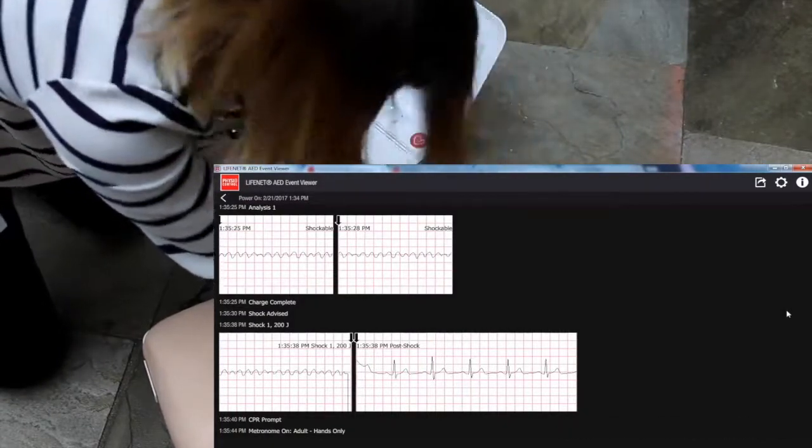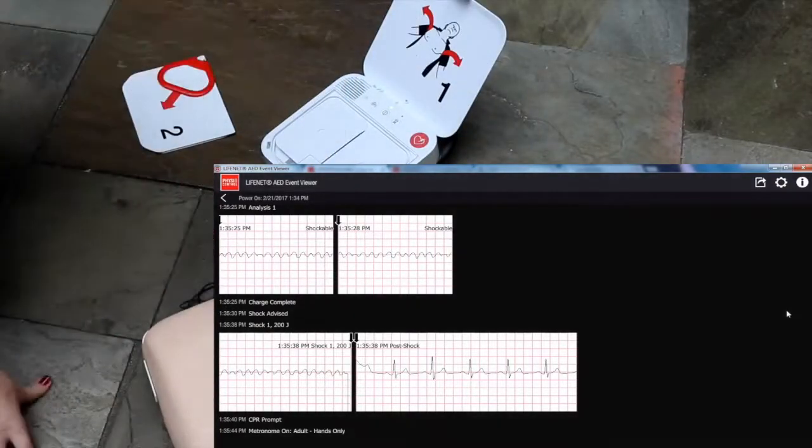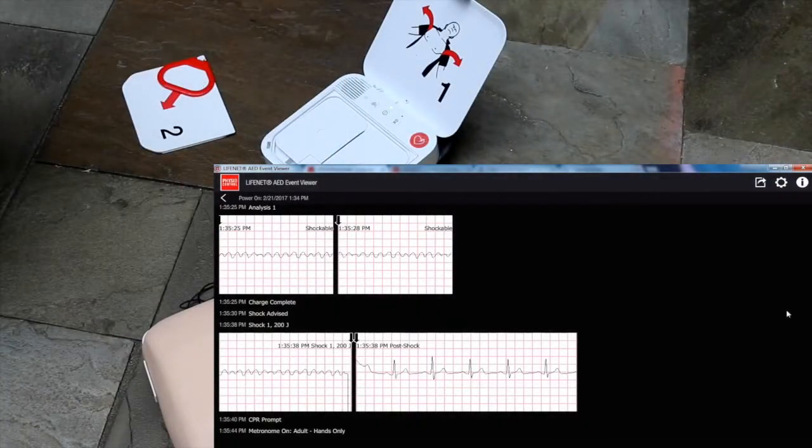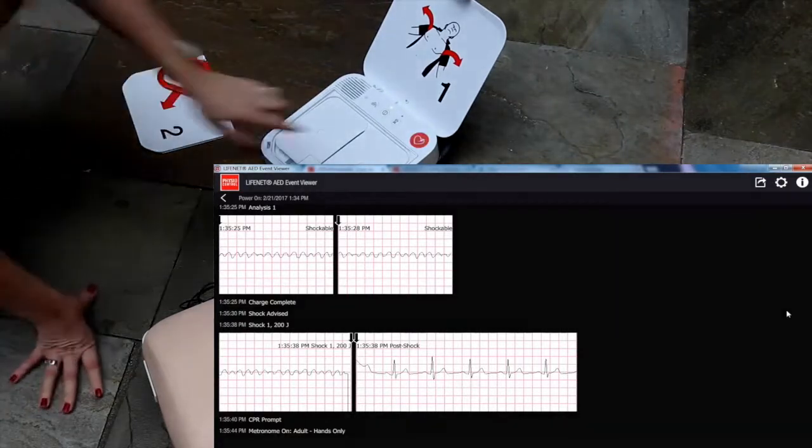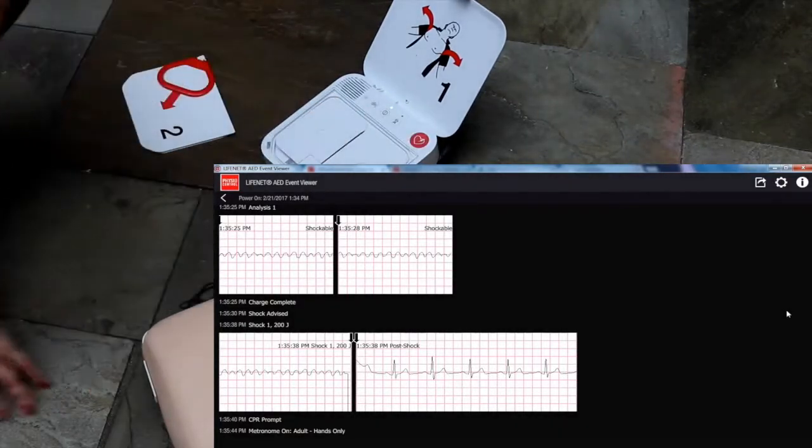Stop chest compressions. Everyone clear. Press flashing button. Shock delivered.